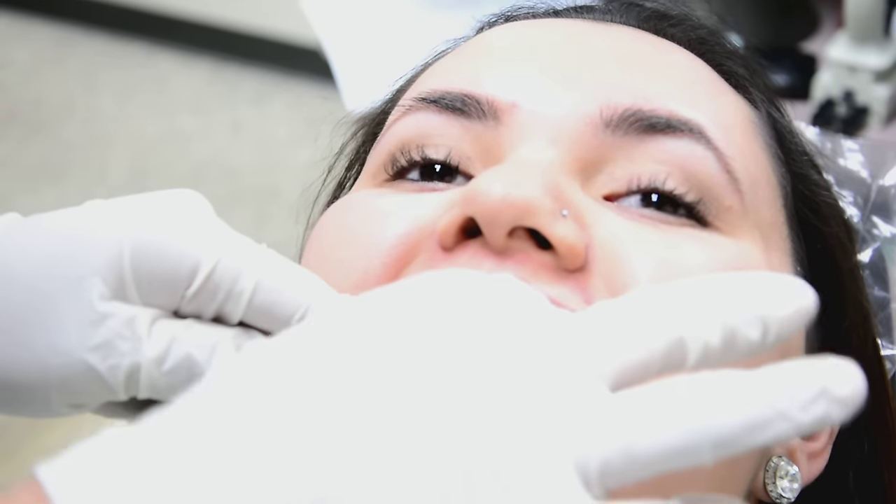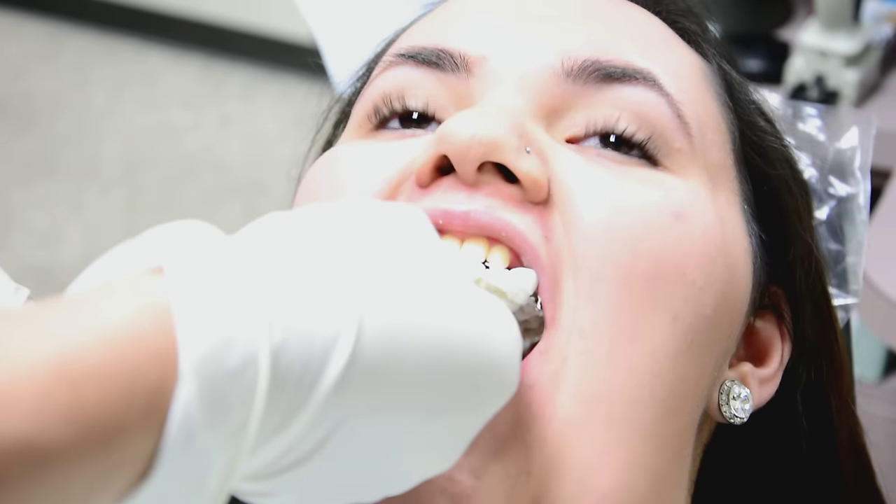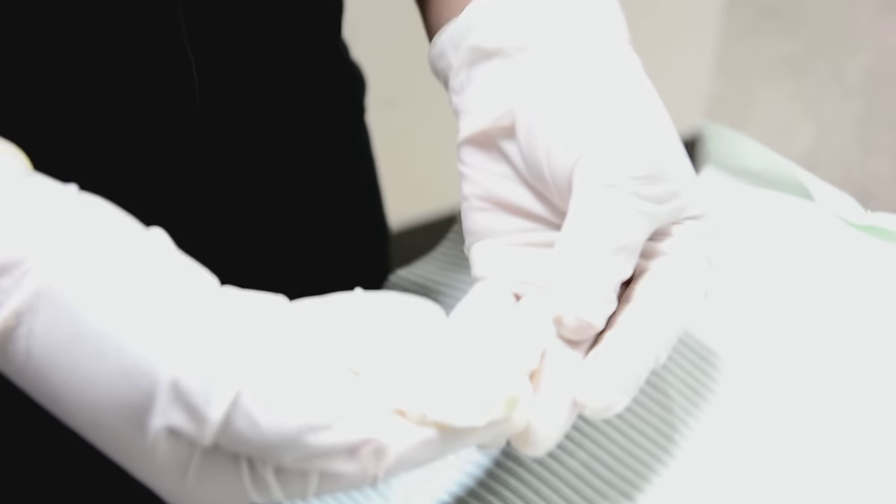The step only takes about 30 seconds to set. The patient closes down for 30 seconds, then opens. It's nice and rubbery — and there you have it: an accurate bite impression so the lab knows exactly how the patient's bite registers.